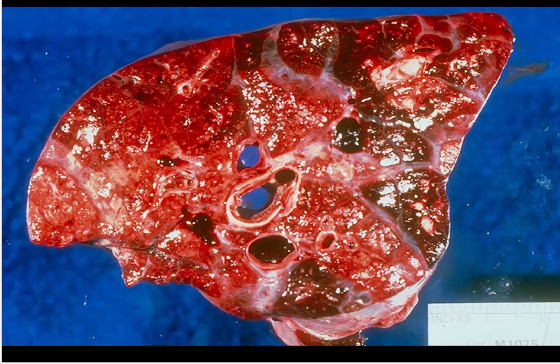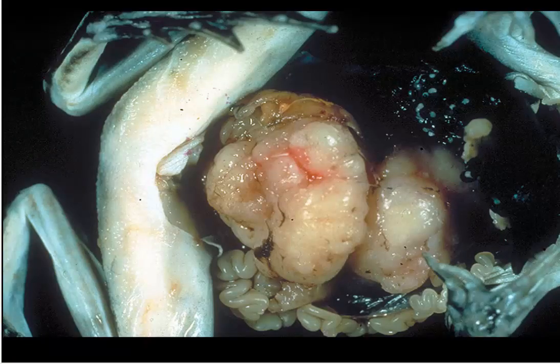Okay, slide number 5. And I remember this slide from when I was a resident in those Wednesday slide conferences. And it's a great slide. This is tissue from a leopard frog. Leopard frogs are ones that you used to dissect in high school. I don't think they allow people to do that anymore. I think it's all done on computers.